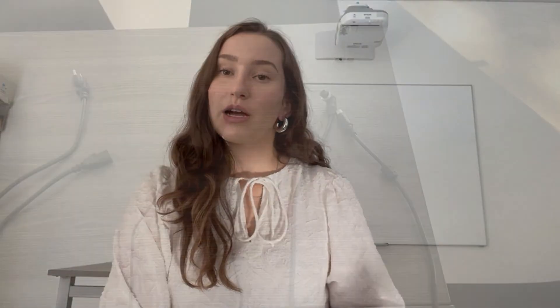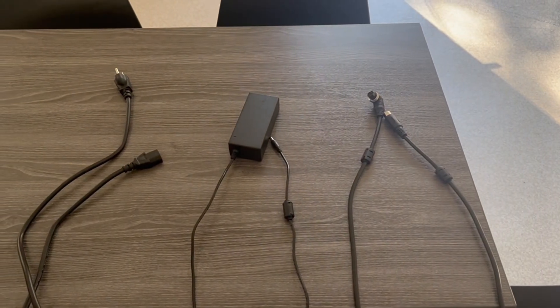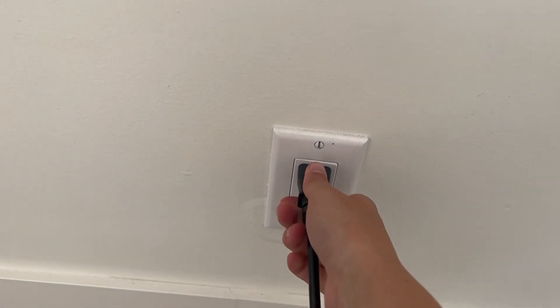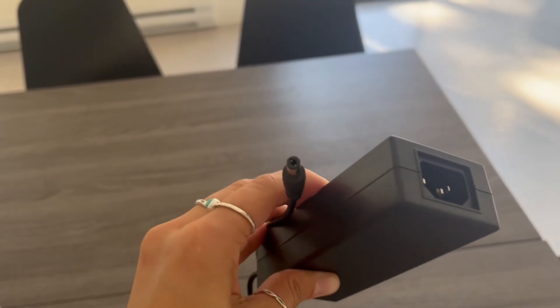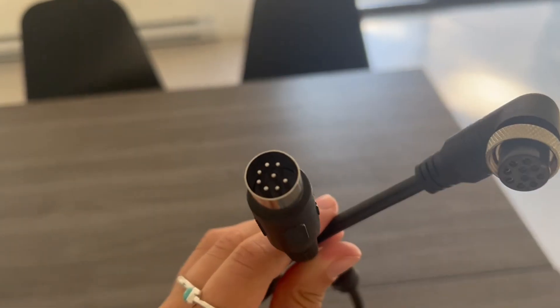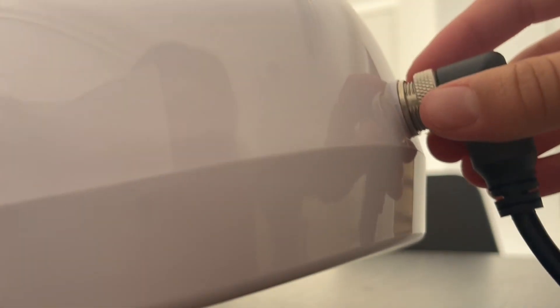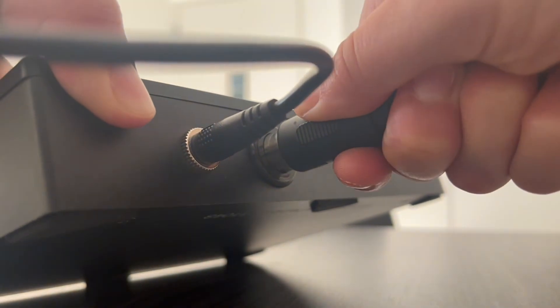Your bag will also come with three black cords. The first cord has one end that plugs into your wall outlet and the other end that plugs into the power bar. The second black cord is a bit thinner and it is attached to that power bar, with one end receiving that cord and the other end going into your controller. Your third black cord has two ends that look similar, but one has a spinny neck on it — this end goes into your helmet and the other goes into your controller.